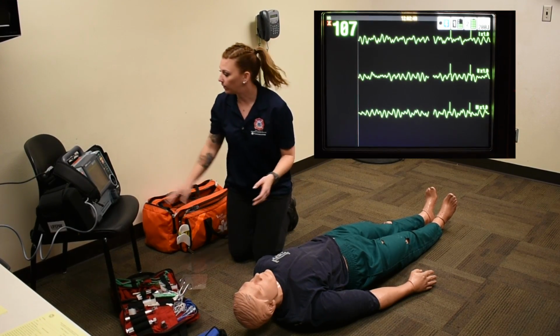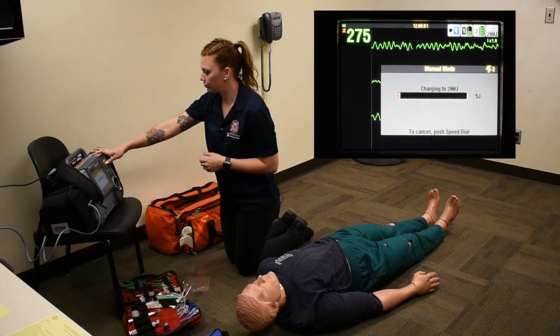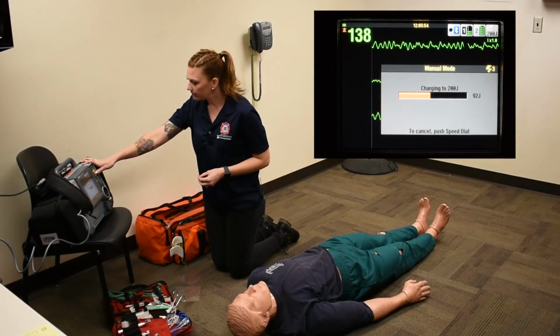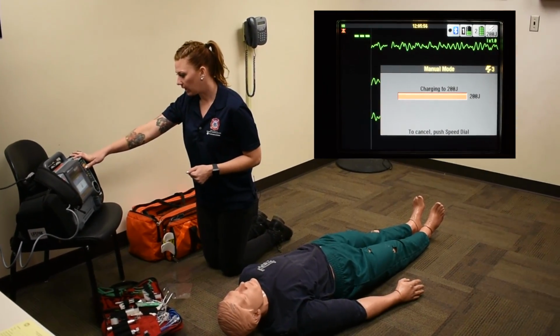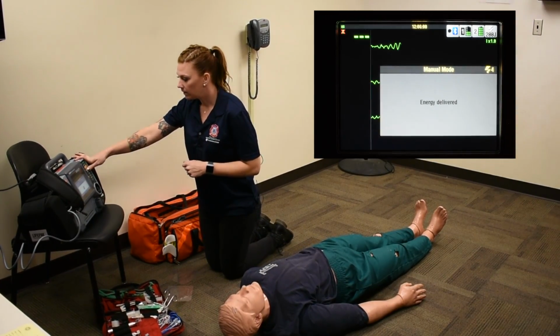I'm going to start CPR right away while I am charging to defibrillate at an energy of 200 joules. So continue CPR. Okay, I'm clear, you're clear, everyone is clear. Going to go ahead and shock.